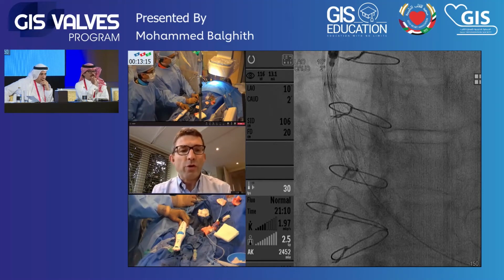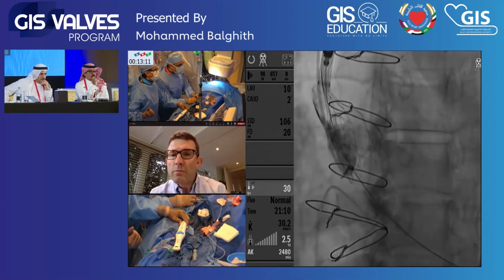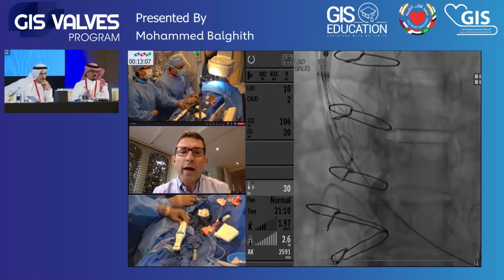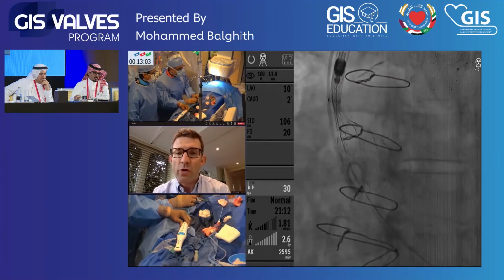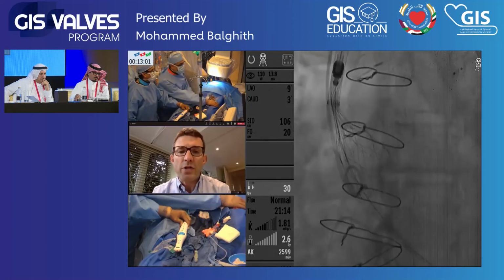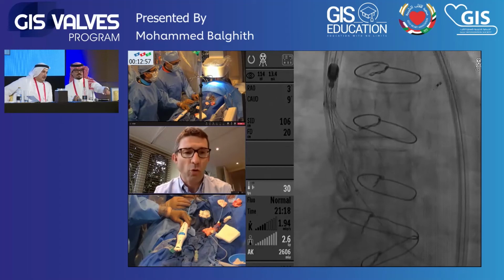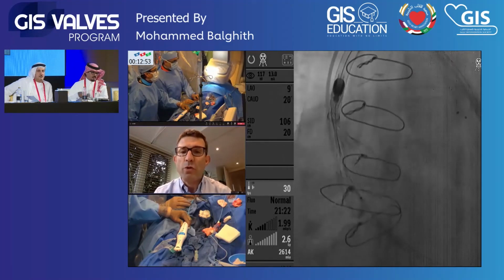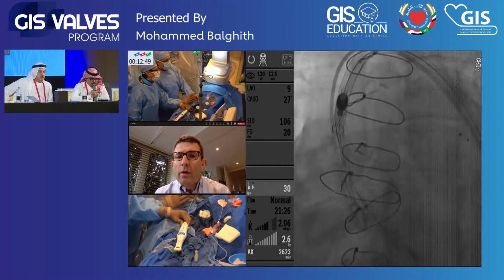Yeah, I would do an aortogram in this view. Inject, please. We've still got a bit of parallax in the view. I think it looks good, but I think what we'll do is correct the parallax in this view. So I think, again, probably just come a shade more caudal, and we'll make sure that we've got the parallax removed in the coplanar view. Is this better? I think doing more views, it's very good.